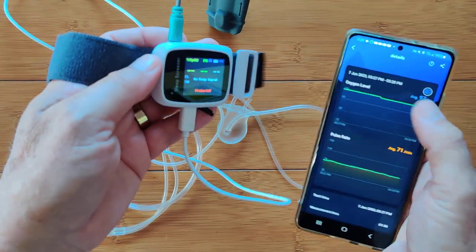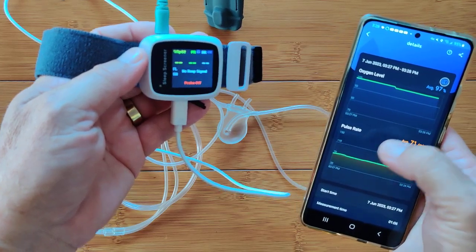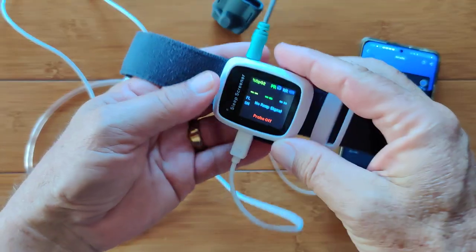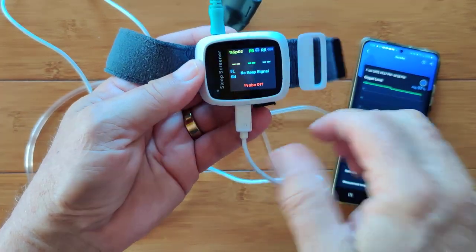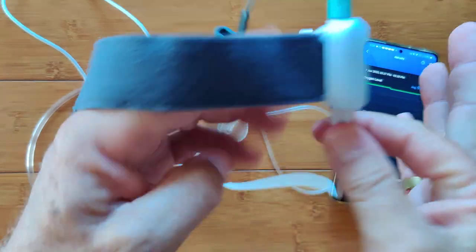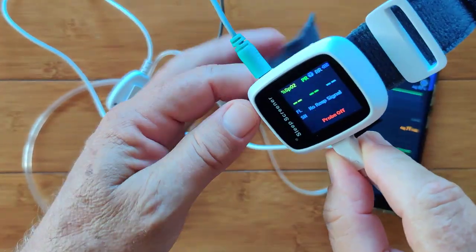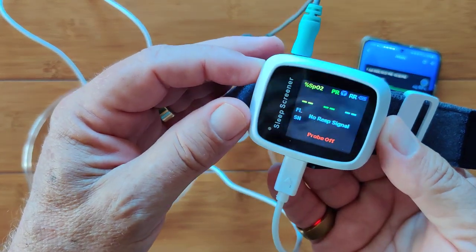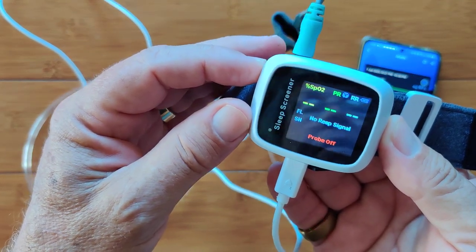Or if you don't have it connected, it will transfer that data later — first to the phone in terms of oxygen level and pulse rate, and to your computer if you connect it up with the breathing information as well. It's a really nice device. It's relatively inexpensive for a consumer device and it does what it says it'll do. Check it out — the AP20 from Vibe.